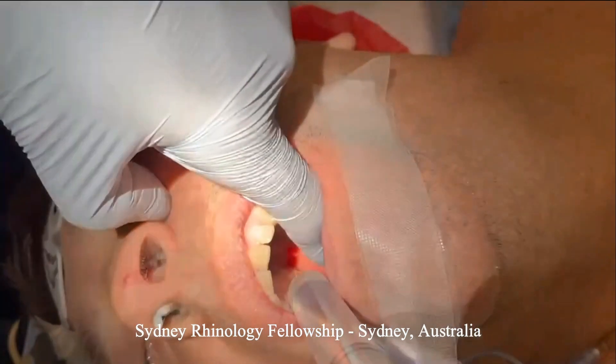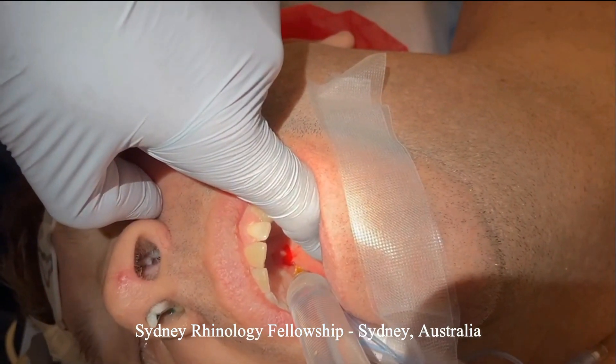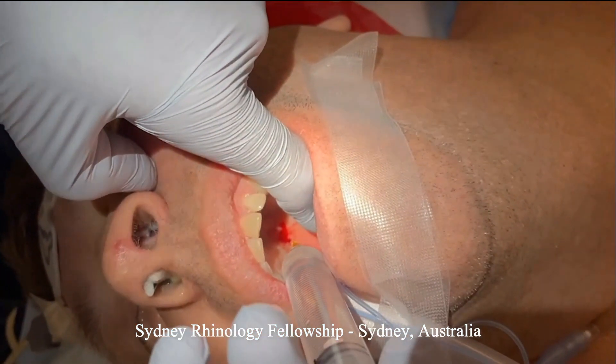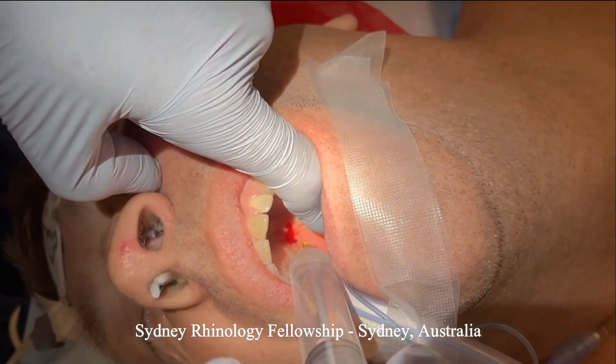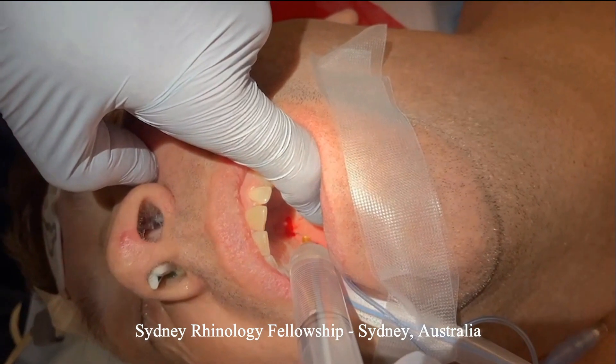Place the injection in, aspirate back to make sure you don't have any blood in there, and then slowly infiltrate 2 to 3ml. You should actually see the entire hard palate on the ipsilateral side blanche.